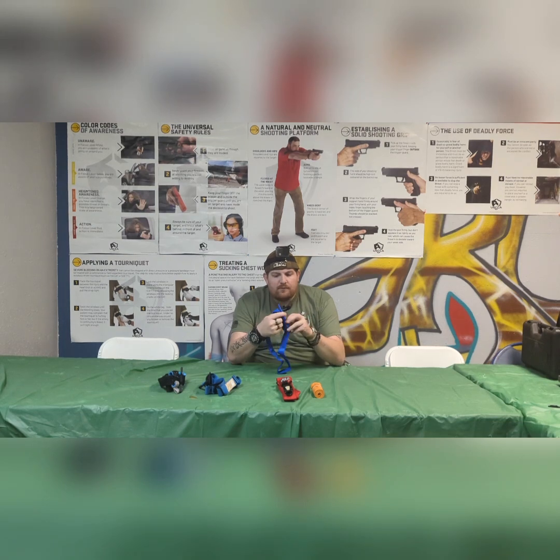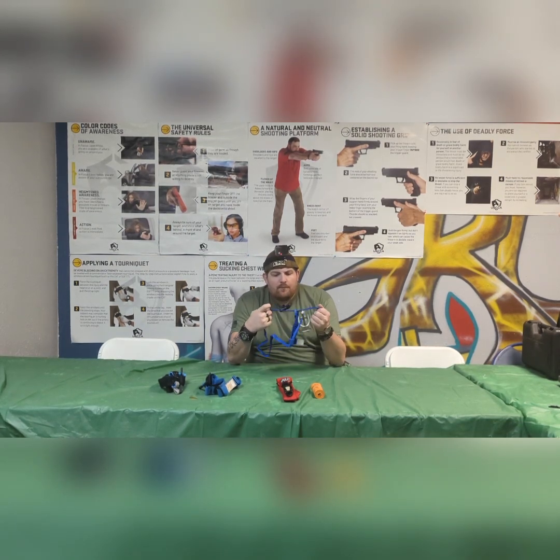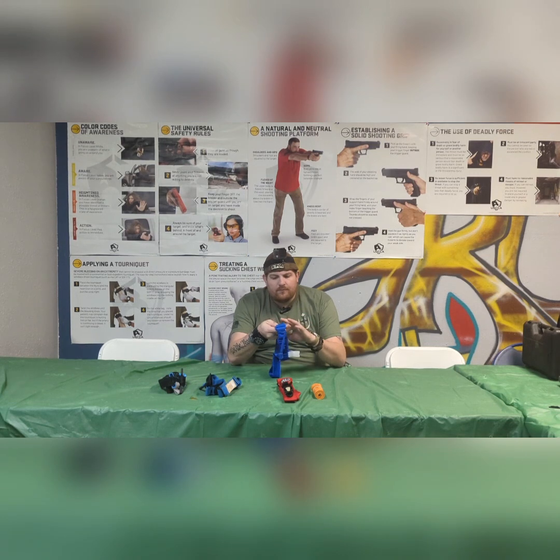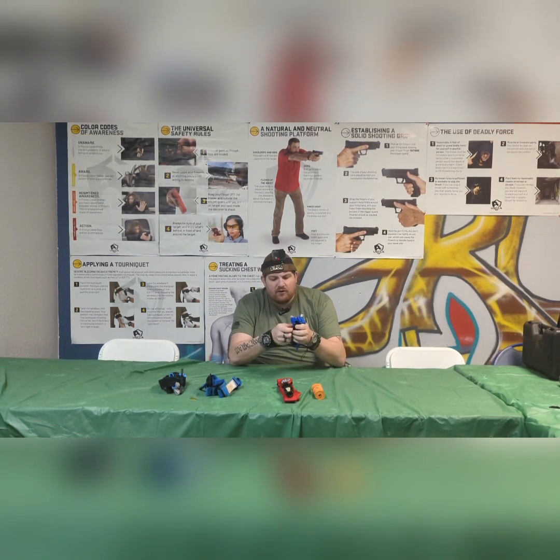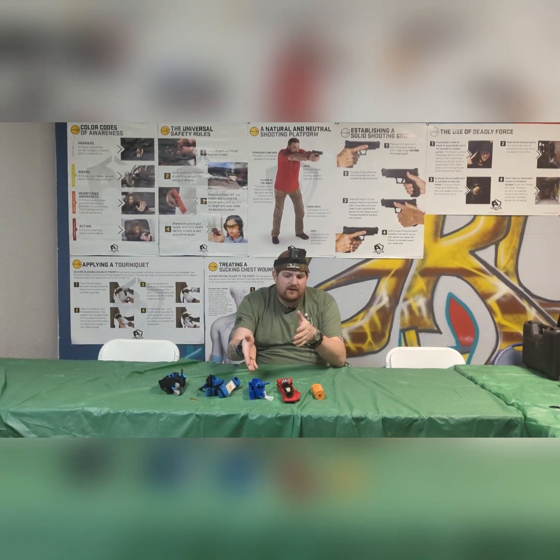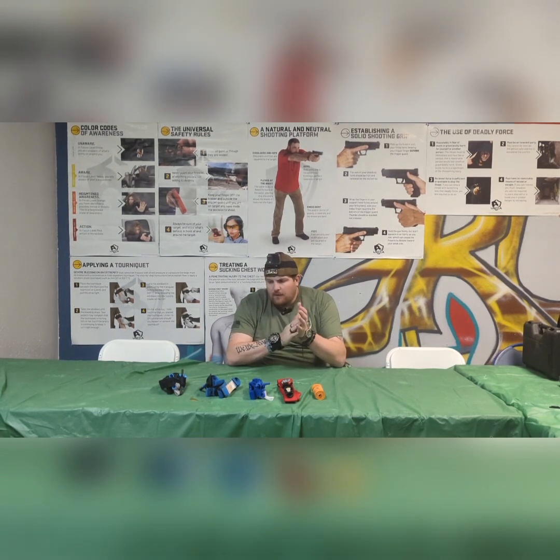It's a windlass tourniquet, meaning it uses a crank device, which is this right here. They're great. They're fast, they're easy. They can be used one-handed, for self-applying or self-aid. So it's a great tourniquet, tried and true. I think everybody should learn this, because the majority of people that know or teach tourniquets are going to use a CAT tourniquet.